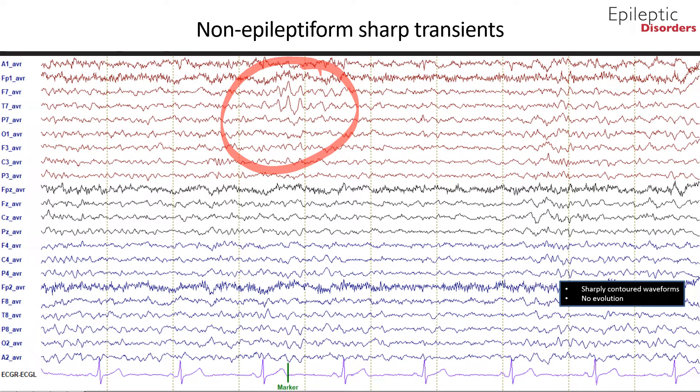Additionally, these sharp transients do not fulfill the criteria to be epileptiform discharges. For a more detailed discussion on interictal epileptiform discharges, please refer to the teaching module on interictal epileptiform discharges, where we discuss the six IFCN criteria.